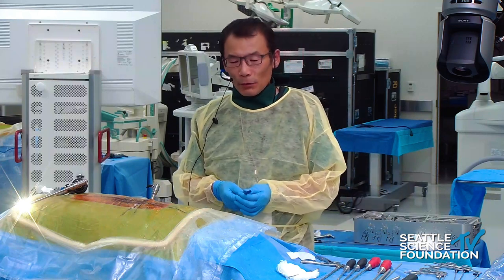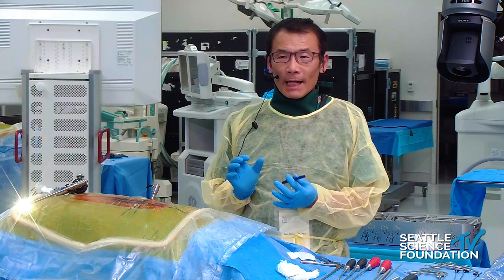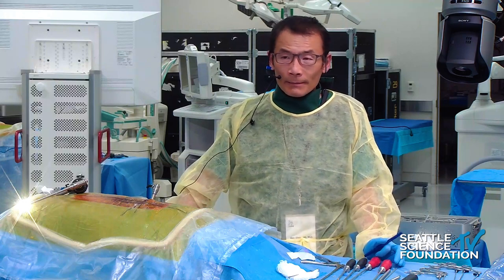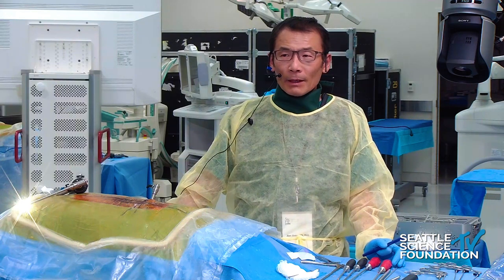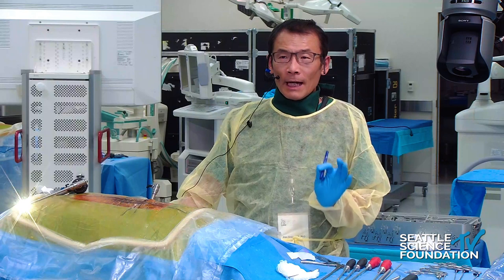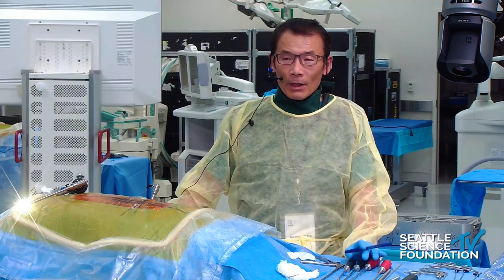So for me, my interlaminar workflow is I do my bone work, discectomy, and place the expandable interbody cage, and then place screws percutaneously. For the portal, I use the lower level screw hole, where you make the incision for the percutaneous screw fixation. I use one of those portals for my discectomy, laminectomy, and release.